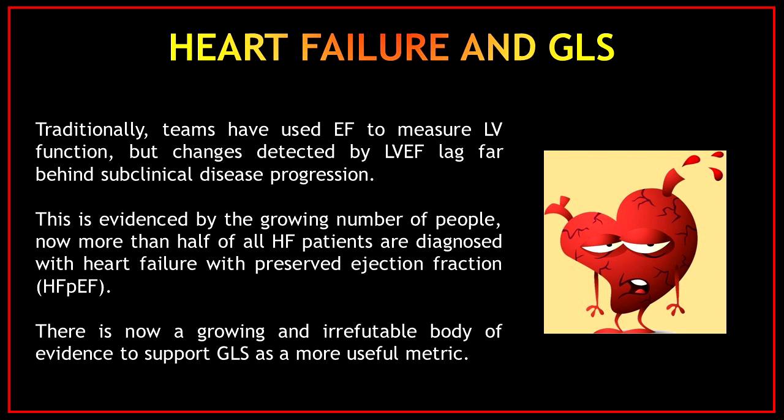Traditionally, teams have used ejection fraction to measure left ventricular function, but changes detected by left ventricular ejection fraction lag far behind subclinical disease progression. This is evidenced by the growing number of people. Now, more than half of all heart failure patients are diagnosed with heart failure with preserved ejection fraction. There is now a growing and irrefutable body of evidence to support global longitudinal strain as a more useful metric.